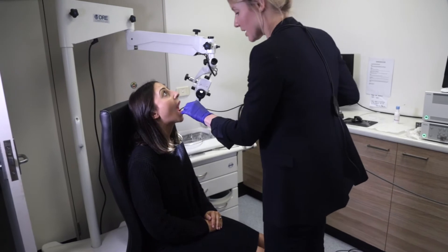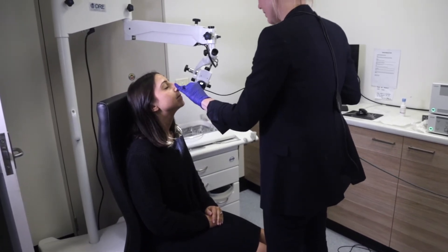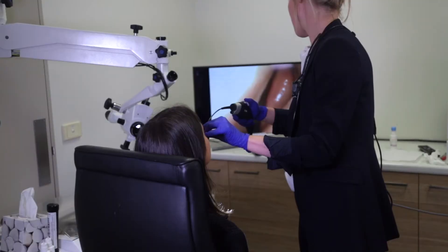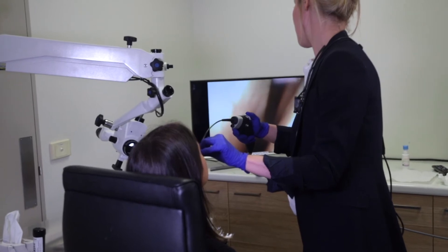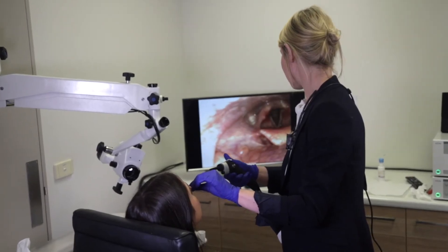The scope is a 2 to 5mm diameter flexible, controllable tube with a built-in camera and illumination. It may be connected to a screen or monitor so that you can see what your surgeon sees. Photos and/or video recordings may also be taken. The surgeon will gently pass the scope into one or both of your nostrils to look at the nasal cavity and sinus openings on both sides. Your surgeon will generally then choose a nostril to continue the evaluation, travelling down the back of your nose, past your palate and into your throat, from where the larynx, voice box and opening of the oesophagus can be seen.